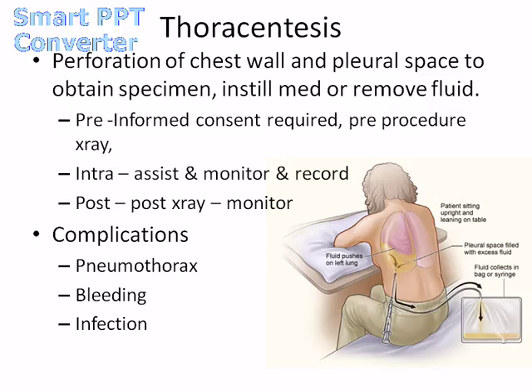Here it shows you the fluid collected in this little bag, but often you'll have vacuum bottles. They're glass bottles where a vacuum is created inside them, so when you insert the needle, it assists with pulling the fluid out. The doc will ask you for a vacuum bottle. I always make a practice of bringing one extra, because it's better to have one ready than to scramble around and try and find another one, especially if you have to call downstairs for it.